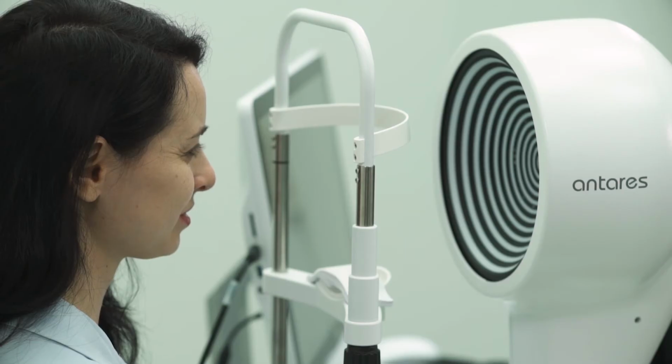It will recognize the eyes automatically, left eye and right eye, so we don't have a problem with that either. And I suggest that we get started on an actual patient.